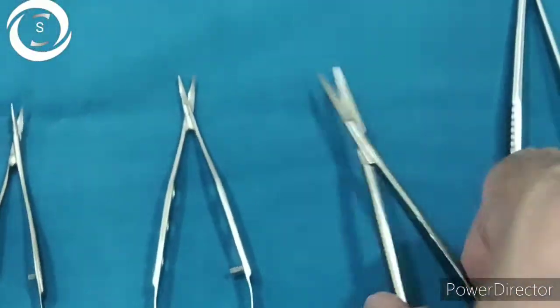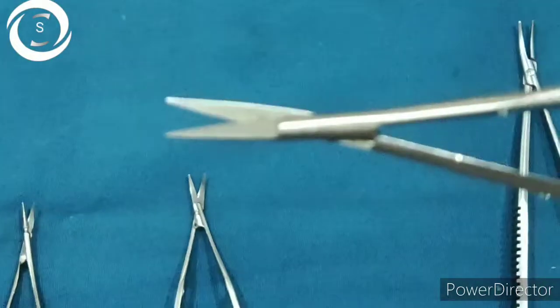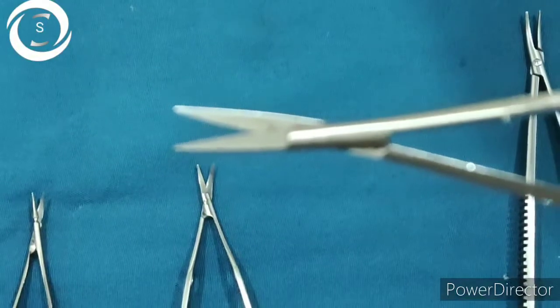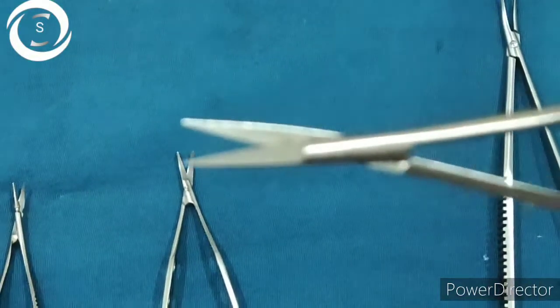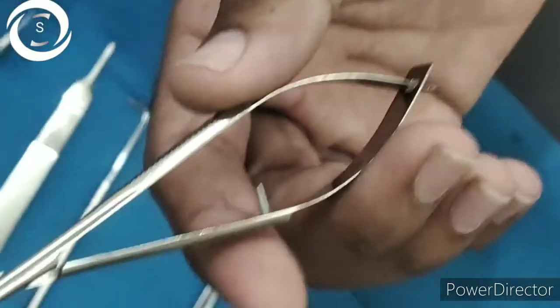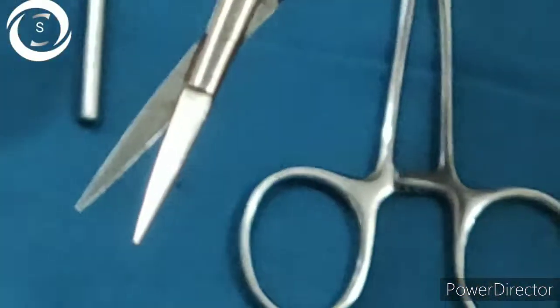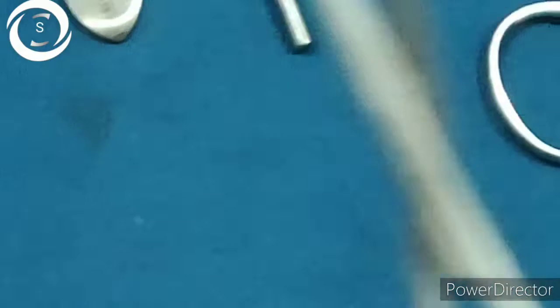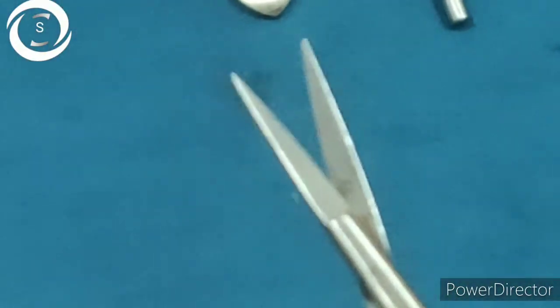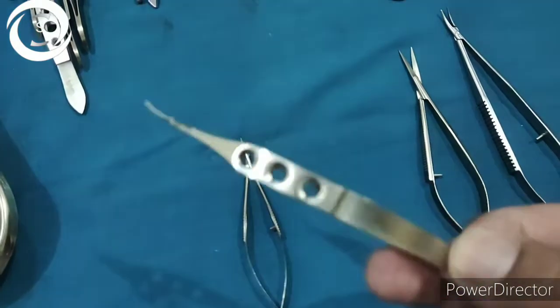On the right are two needle holders and on the left are three scissors. The largest scissor has sharp cutting blades — blades can be straight, curved, or angled. This is the conjunctival Westcott scissor, with straight blades. It is used in DCR, squint, lid, and conjunctival procedures. The differentiating point from the needle holder is sharp versus blunt blades.